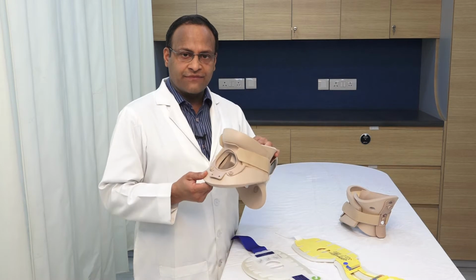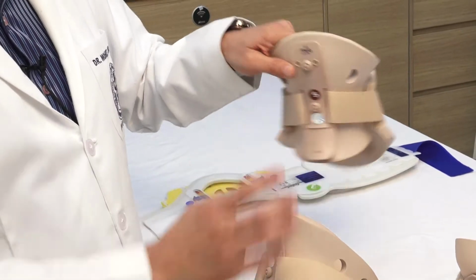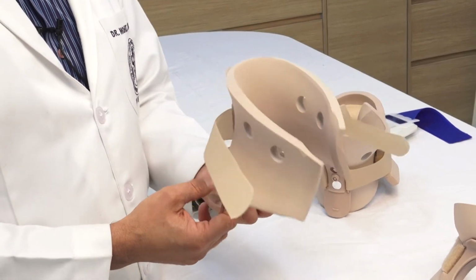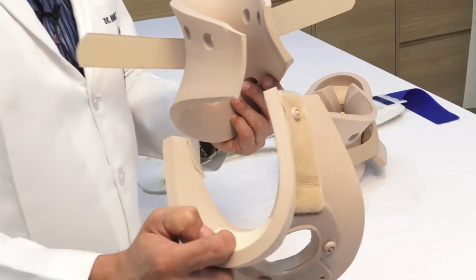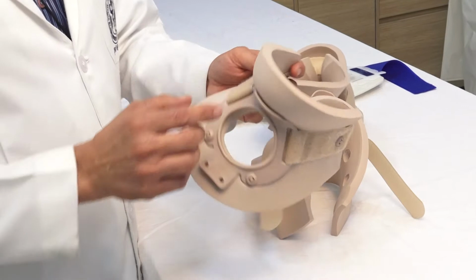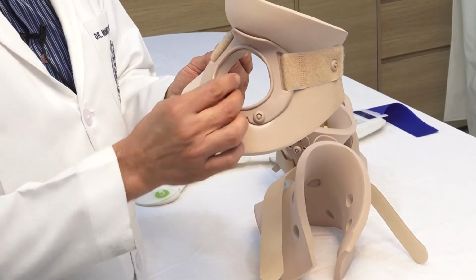One comes in a prefixed size, in various sizes like small, medium, and there's a large one also. They have two components: the anterior component and the posterior component. To identify them, the anterior one has a hole in the center through which one can manage the airway.